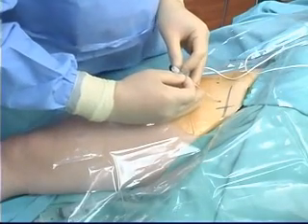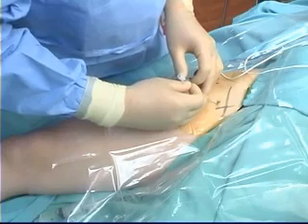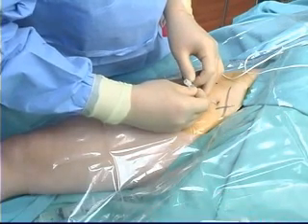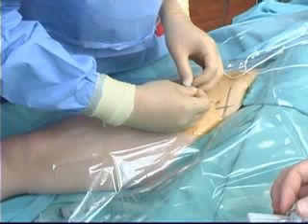The patient is positioned supine with the foot neutral, neither externally nor internally rotated. After palpation and marking of the femoral artery and the inguinal crease and disinfection of the skin, the area is covered with a sterile fenestrated transparent plastic drape. The skin, subcutaneous tissue, and intended path for the tunneling of the catheter is anesthetized with lidocaine and 1 in 200,000 epinephrine.